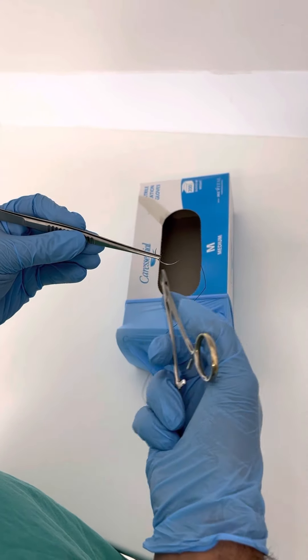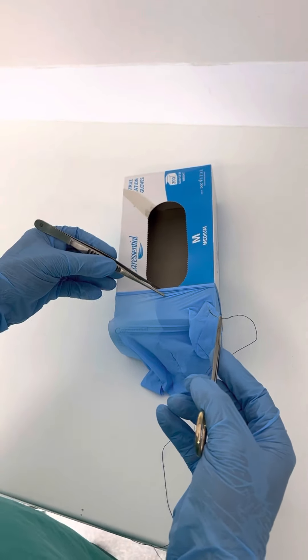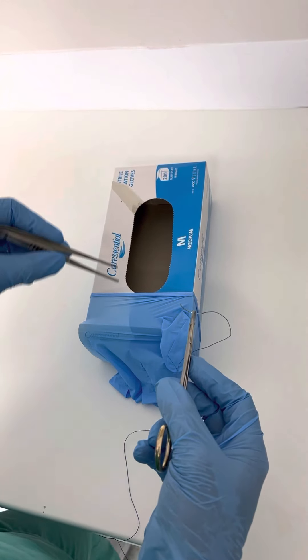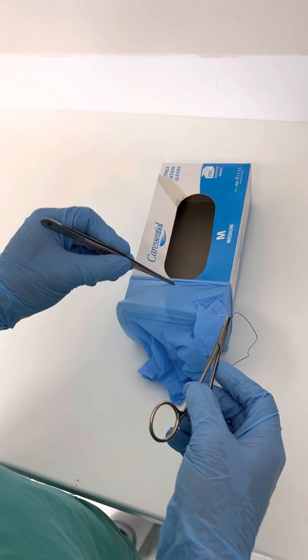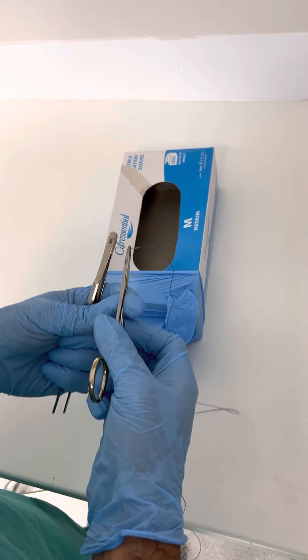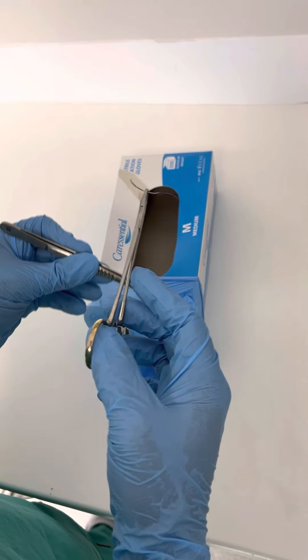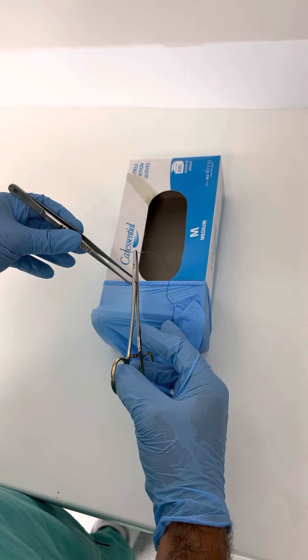What we're going to do is use a model here — we've created an empty box of gloves with a cheap glove over it — and I'm going to do a single suture here. We've already seen how to handle these instruments, so I'm not going to repeat that, but you might want to watch the previous video.